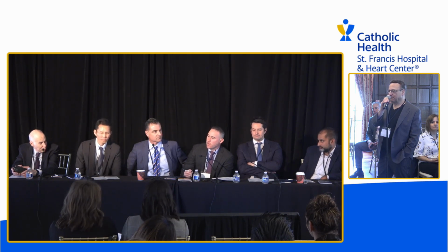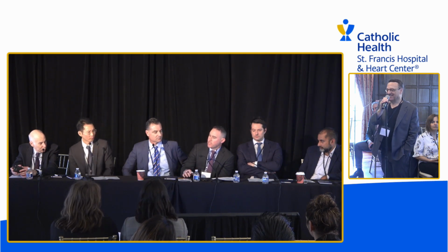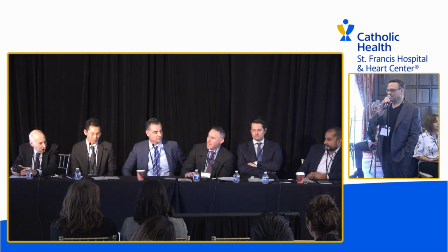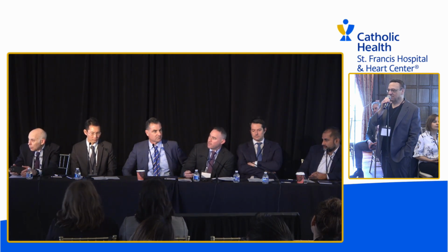In a 91-year-old, the STS calculator doesn't allow us to put multiple procedures other than an AVR CABG or a mitral CABG. It doesn't allow for double valve. So we can only infer or extrapolate what would happen, based on, I guess, a 91-year-old going in for a double valve operation would make him a lot higher risk.